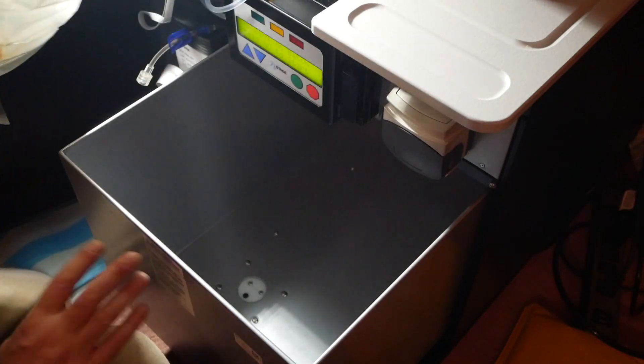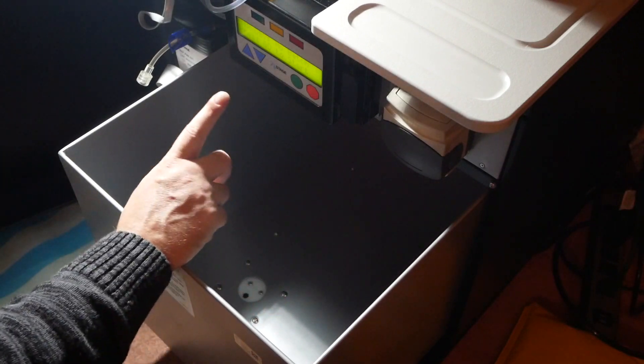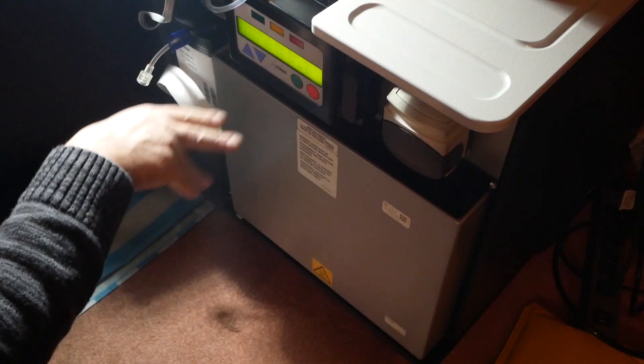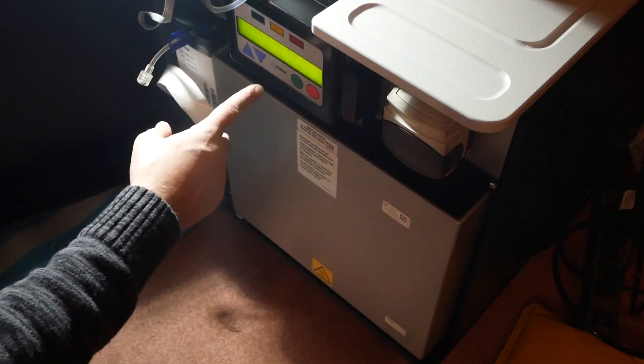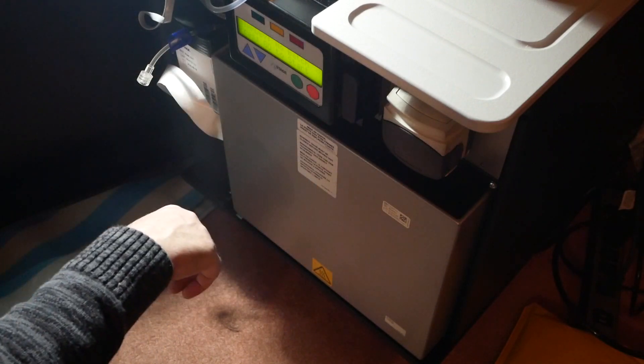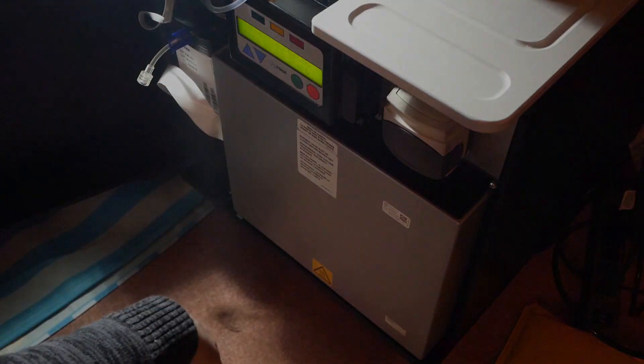That's how you remove the sack. Once that's out and thrown away, this is empty and nothing is connected that you need to worry about. You can turn the machine off until you're ready to actually make your next batch, which is what I'm going to do.